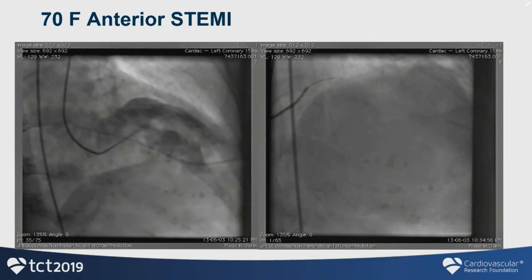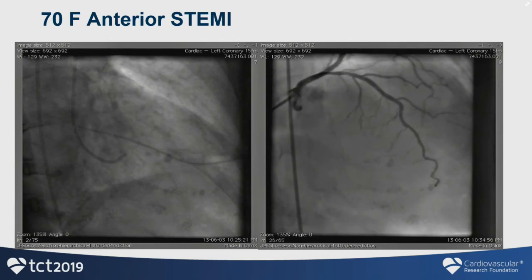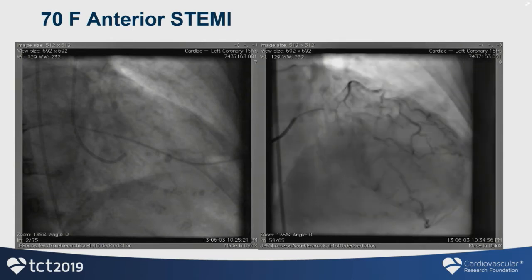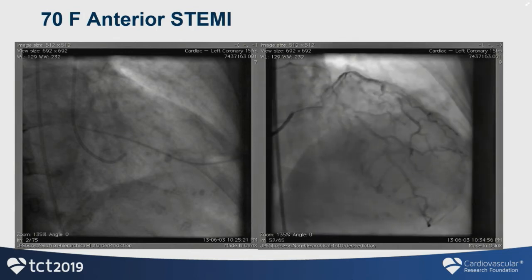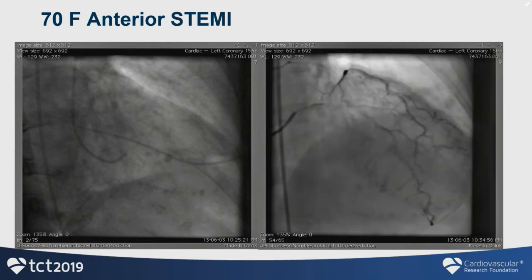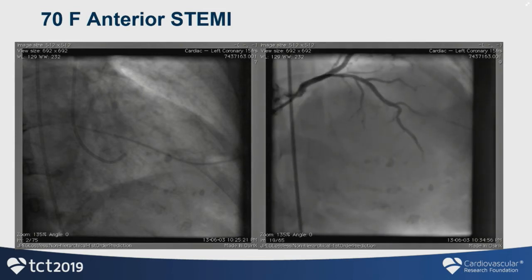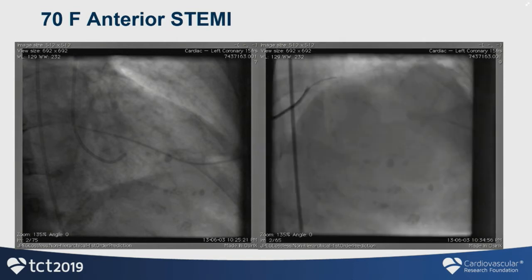Last case, this is a 70-year-old female with anterior myocardial infarction, a ventriculogram that shows anterior apical and infraapical wall motion abnormality, in keeping with what would be likely a Takotsubo cardiomyopathy based on the ventriculogram alone. But then you're confronted with this angiogram, which shows a moderate to severe proximal LAD stenosis and a wraparound LAD anatomy. Could this have been a thrombus in the LAD that lysed and produced that kind of a wall motion abnormality? We certainly wouldn't want to send a patient with an acute LAD plaque home without a stent if that's the degree of wall motion that they acquired.